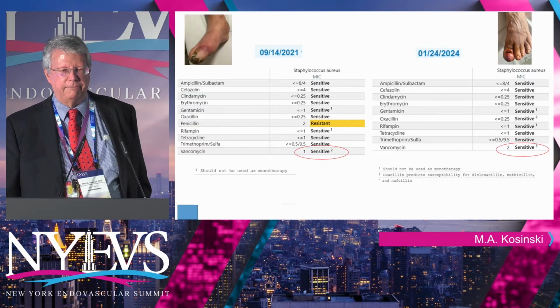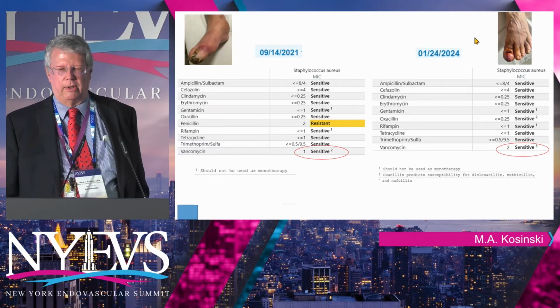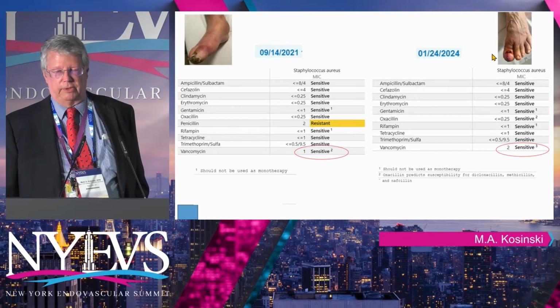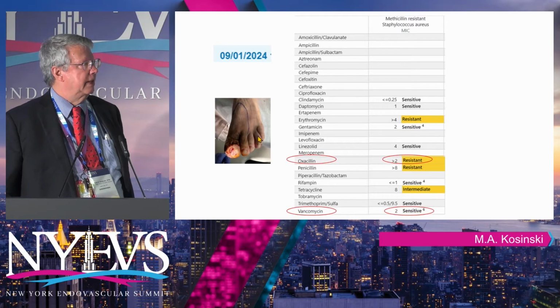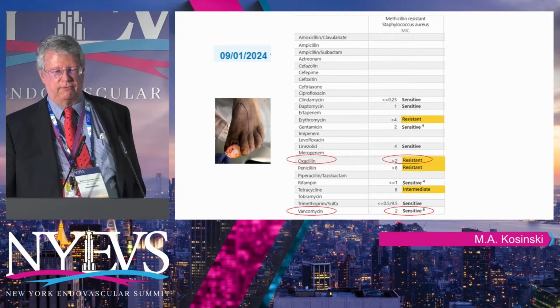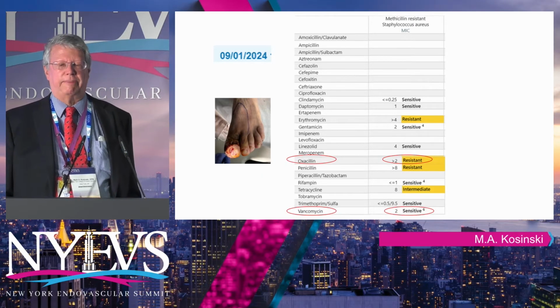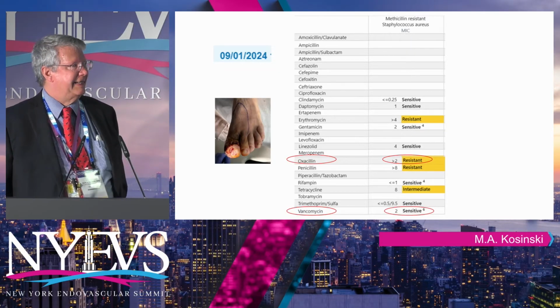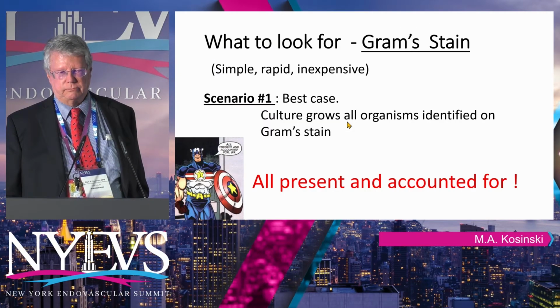My point being, this is the same patient, the same skin, right foot, left foot. Again, left foot, and look, now we've got an MRSA 3 years after the patient first came in. So with the evolving resistance pattern of this strain of MRSA, you need to realize that the date and the time that you take these cultures from is critical.